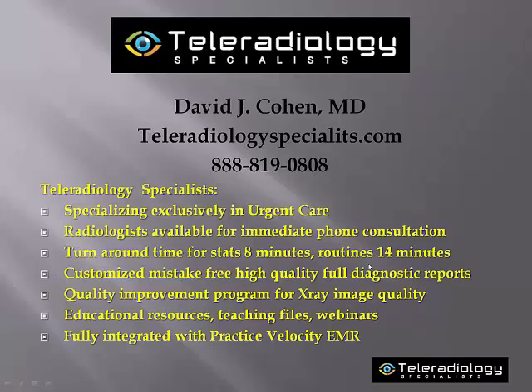The topic for my presentation today will be called Urgent Care, Radiology, Common Fractures, and Pitfalls. All of the cases we'll be looking at are actual urgent care cases that have come from the centers where we read for. We've collected these cases into a teaching file over the years, which we make available to the providers as an educational resource. We also use this teaching file to create educational presentations like this one.